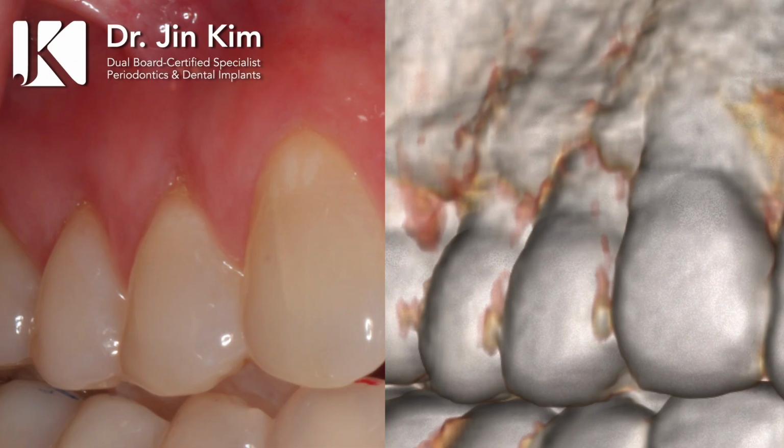So this area in question, let's look at the three teeth involved, the canine and the two premolars. Both of the premolars display root exposure, gingival recession, and the x-ray substantiates that by showing how much bone is missing. The interesting one is the canine. That's the tooth on the right side of the screen. It really has very thin bone remaining. It doesn't look like a lot of recession, but a lot of the bone has thinned.